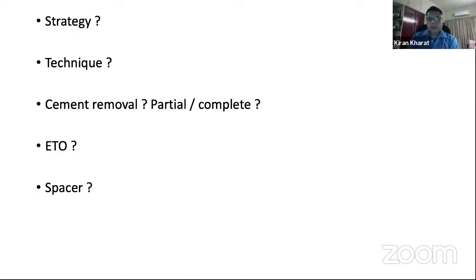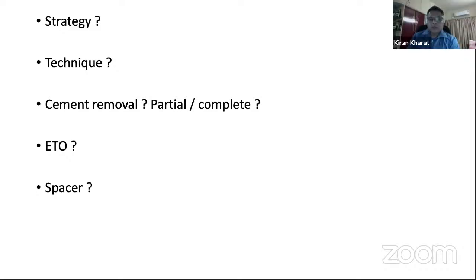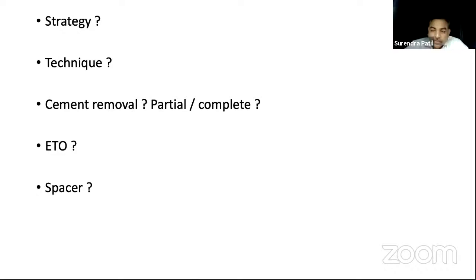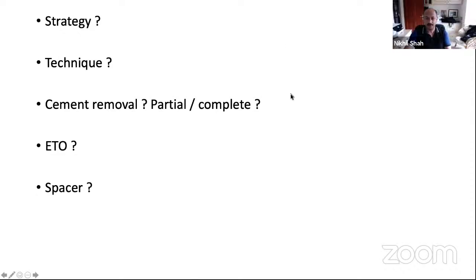I have used a K nail with antibiotic cement in the clover leaf part. Yeah, in some cases. Kiran, you have worked in the UK. Yeah, in some cases where we felt, as we discussed earlier, that it could be a patient who may not come back again, and the infection looks very low grade, simmering, maybe tubercular at times, we have loaded the antibiotic streptomycin on the cement and gone in for a dual mobility cemented, like Akash showed, something which is snap fit into the head, and used it as a spacer. And some patients have not come back. So that's like a Kumar's only. That's practically like a Kumar's. Yeah, okay, something like that.